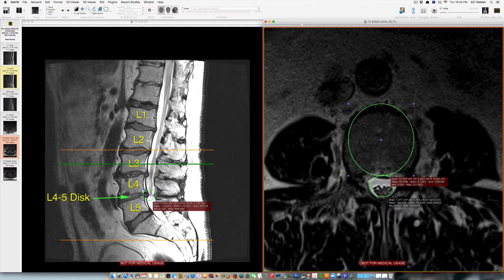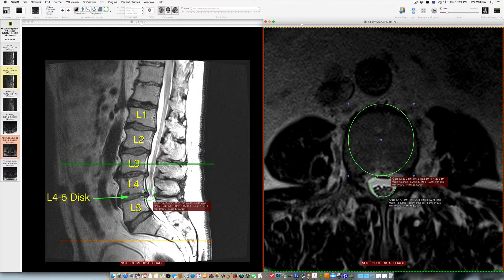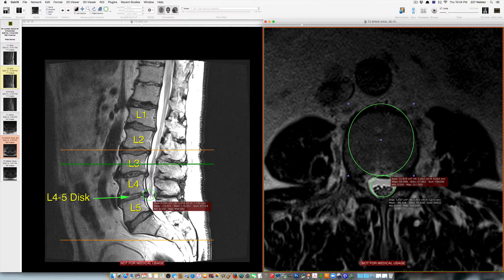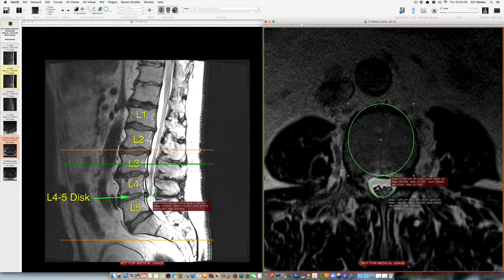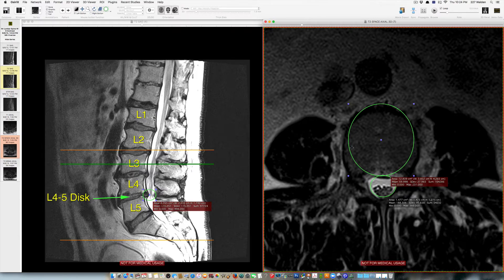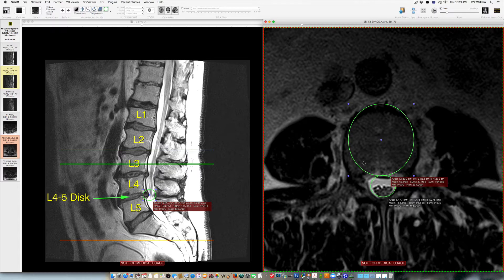And if I go here you can see that I've circled the normal area of the spinal canal here, and on this patient the area of that spinal canal is about approximately 1.4 centimeters. Just anterior to that is the vertebral body and then the space normally occupied by the intervertebral disc.